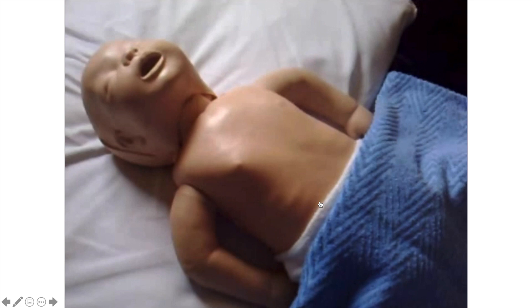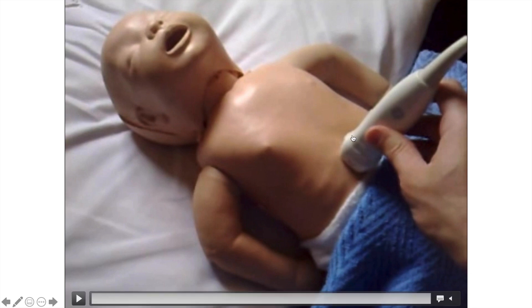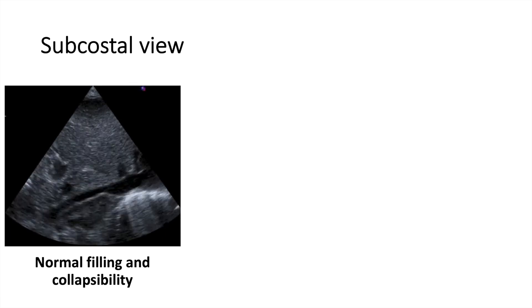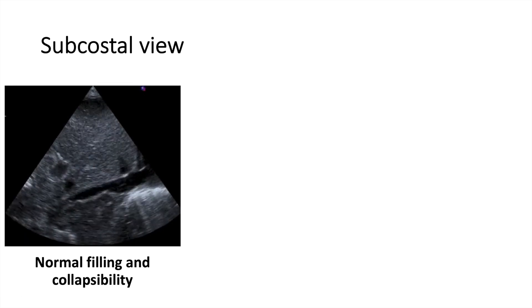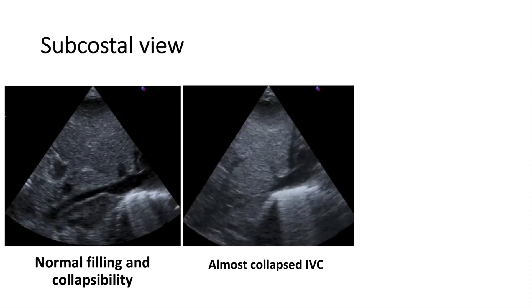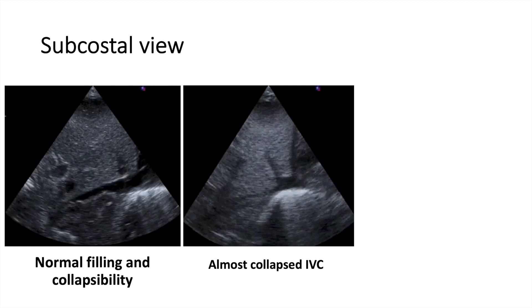How do we get it? We put the probe subcostal under the xiphoid and the pointer is up towards the baby's head — basically in the midline. We look at the filling and collapsibility of the IVC, because the IVC will collapse and expand with breathing cycles. Look at this one — the IVC is almost collapsed and not really well filled. This could suggest hypovolemia, so you may consider giving fluid in this case.